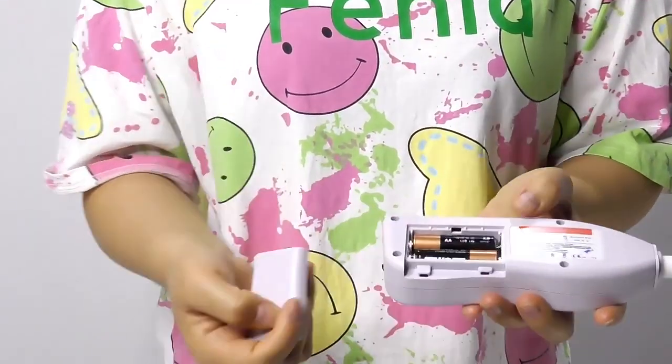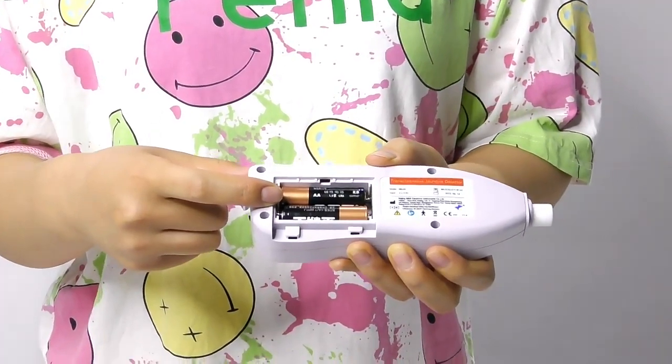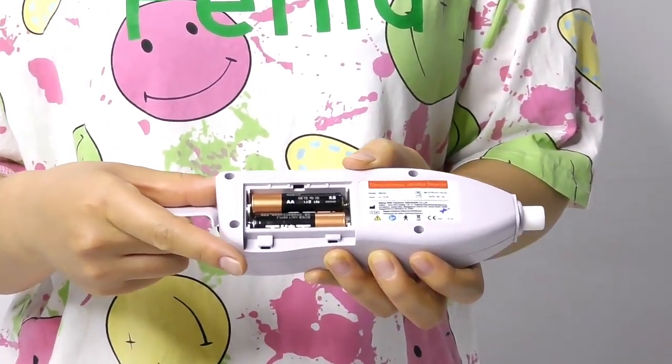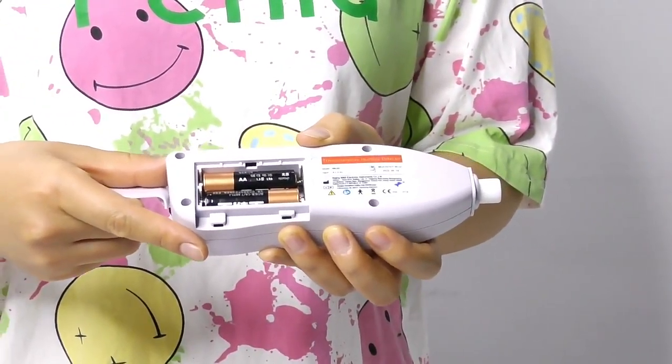On the back side, this part is the battery compartment. It uses two common AA 1.5V alkaline batteries, which users can find and replace easily in the local market.